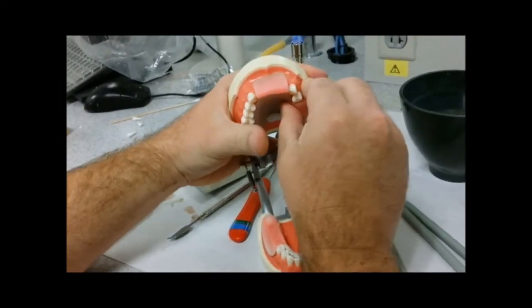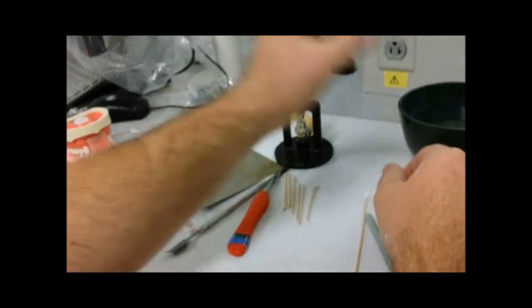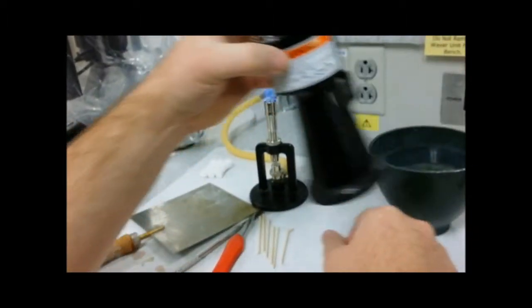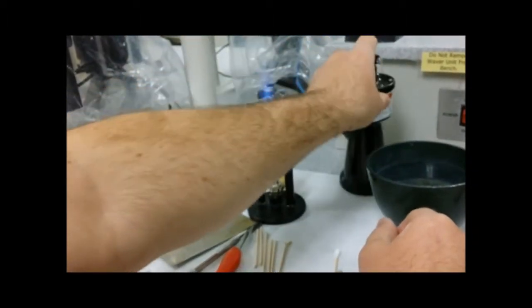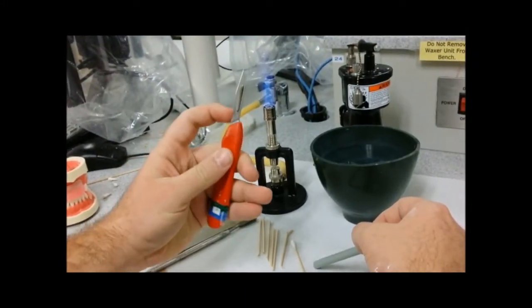The first tools you're going to need today is your propane, your butane torch, your hanol torch, a hot water bath, you're also going to need a 25 razor blade.